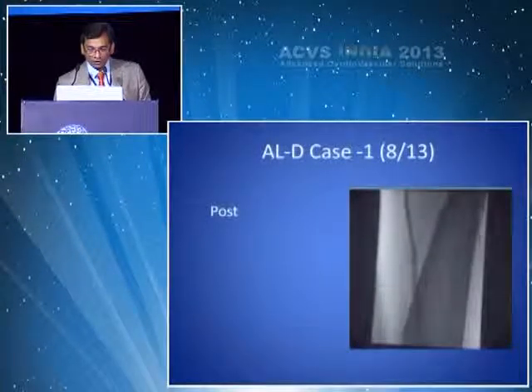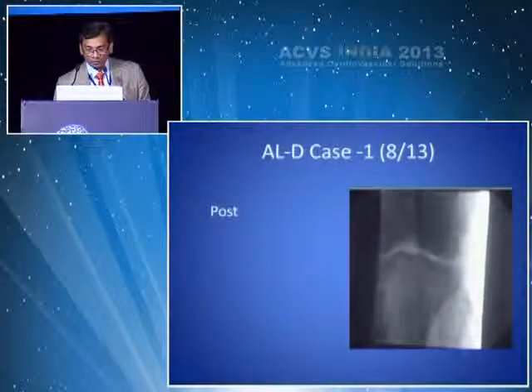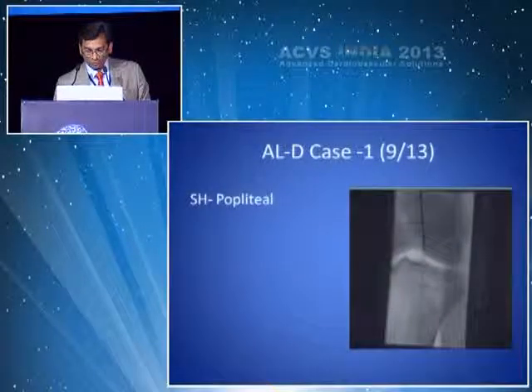Here's after the first pass, Silverhawk of the popliteal.